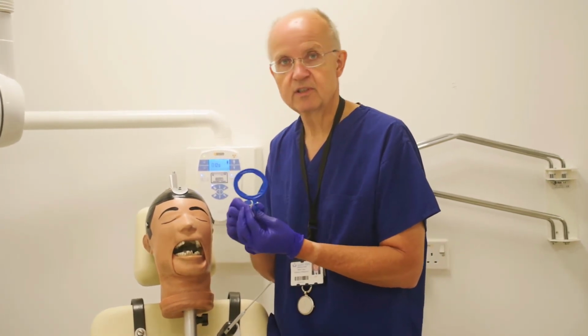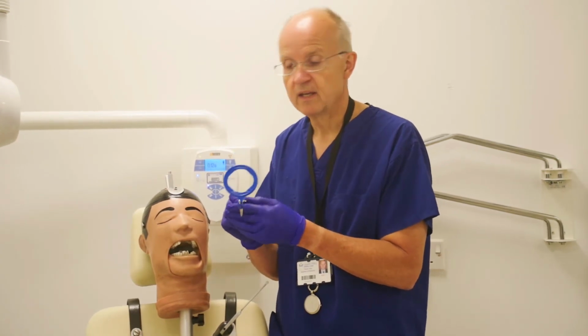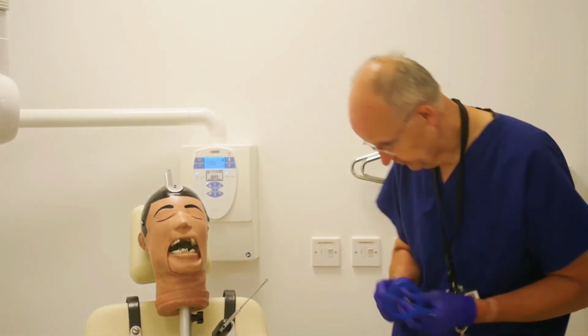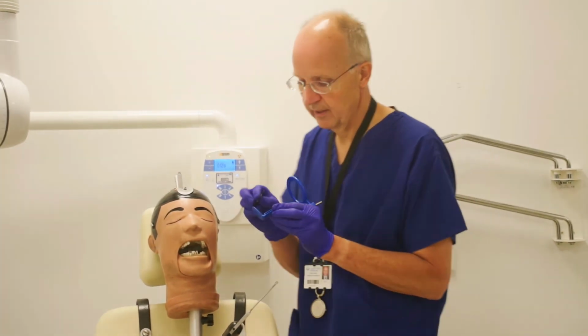So sometimes it's a good idea to get something to place underneath, and we use a cotton wool roll. So I'm just going to ask Carly if she could pass me a cotton wool roll, and I'll show you how we're going to use that.